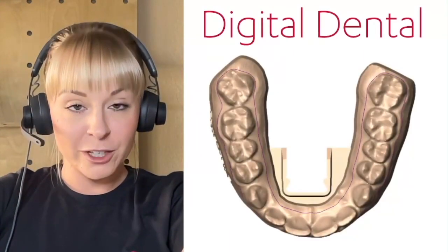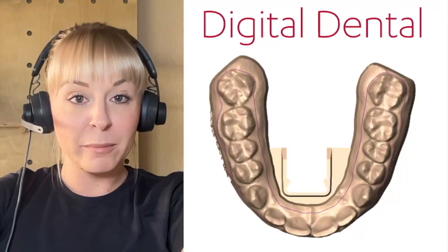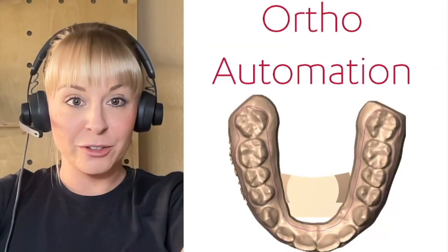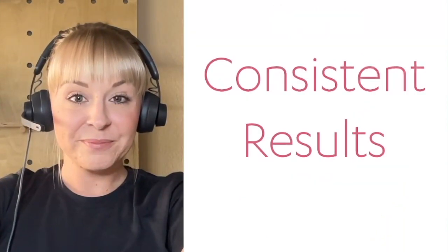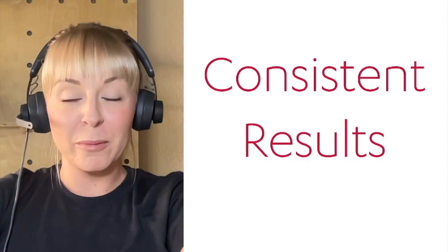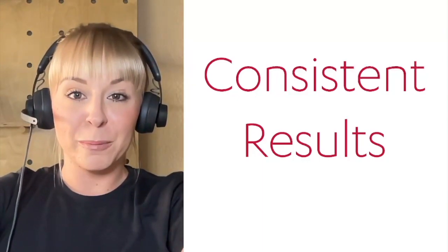We offer two different fixtures today that work with two different milling machines: the Digital Dental Fixture and the Ortho Automation Fixture. You're going to get the same consistent results that you get with all of your 3Shape Automate products, now available for your models and trim lines.